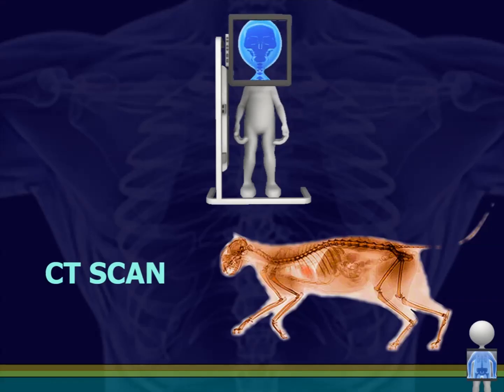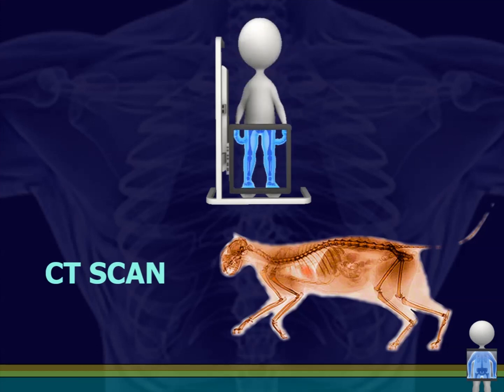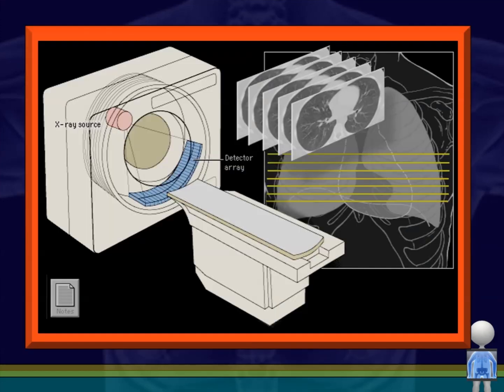Let's talk a little bit about CAT scan. The differentiation between CAT scan and X-ray, what we might do with it. Again, we're only going to touch on this very briefly. So how does a CAT scanner work?